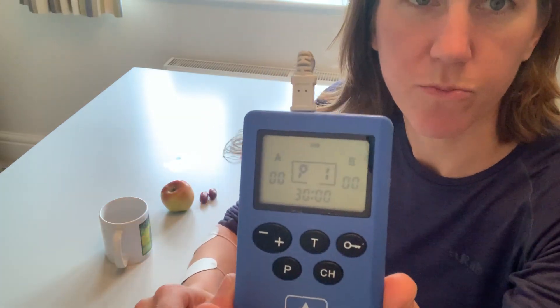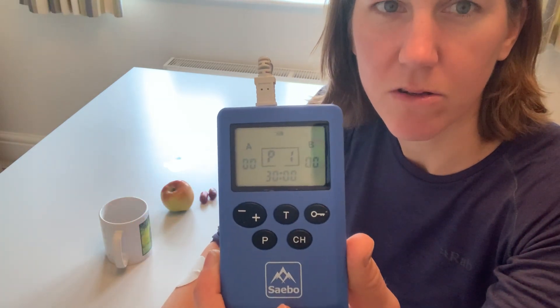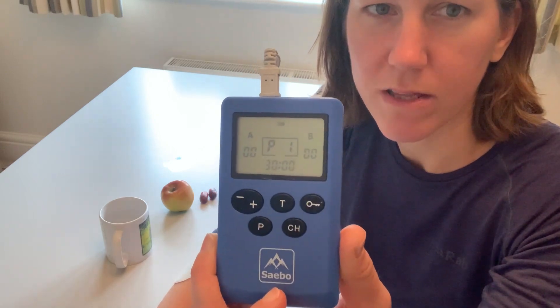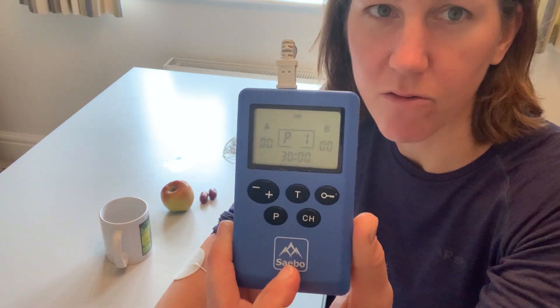I'm going to choose program one — I've already turned it on at the side and I've got program one set up. It's a typical setup on this program of 30 minutes, with a contraction time of about nine seconds and a relaxed time of five seconds.